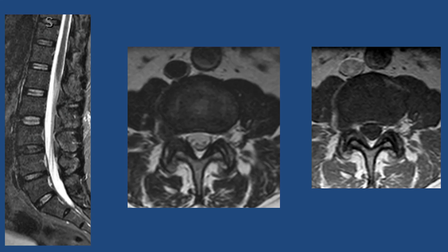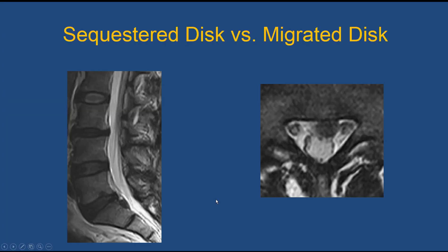On this particular patient, a cursory look shows disc degeneration at L3-4, and the spinal canal looks okay at first glance. But on close inspection, the patient not only has a sub-articular disc but also a foraminal disc — and the disc is herniated out into the far lateral area of the spine. You can see how this would be difficult to reach by a standard laminectomy approach; the whole facet would need to come off to reach that far lateral or lateral foraminal disc herniation at L3-4.